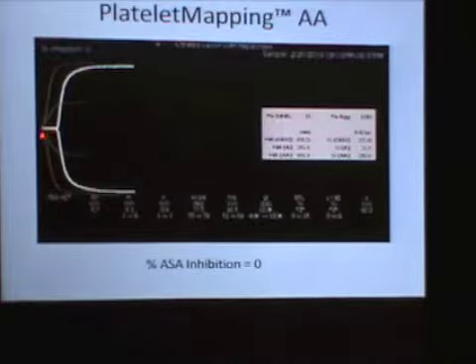You put them on heparin, you lengthen the R time. If the MA stays wide, we know the hypercoagulability is platelet based. Then they need to go on platelet inhibition. If the R lengthens out and the MA narrows, then we know it's thrombin based and they need to go on long-term Coumadin, to protect them.